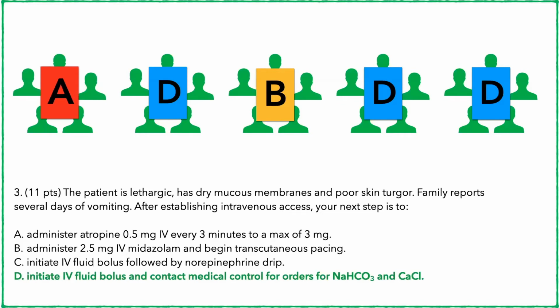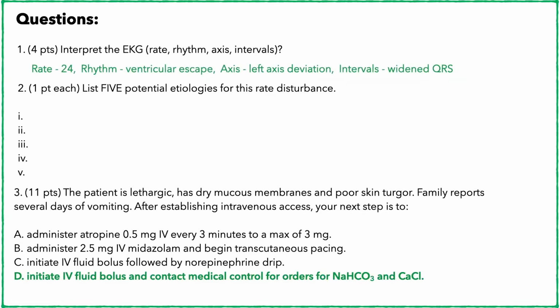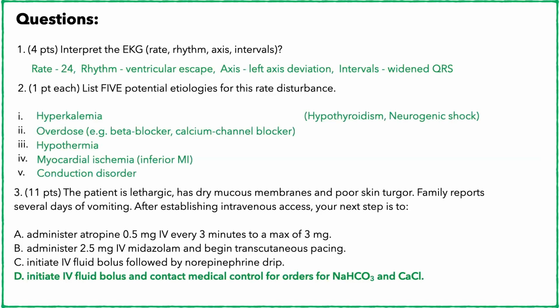And then I'll share what I think is the answer, okay? Which in this case, IV fluid bolus and contact med control for orders for sodium bicarb. And then after I share what I think the answer is, we go through the other questions and sort of put together the whole overall picture. So we'll talk about the interpretation of the EKG. And then we'll talk about what is the differential diagnosis.